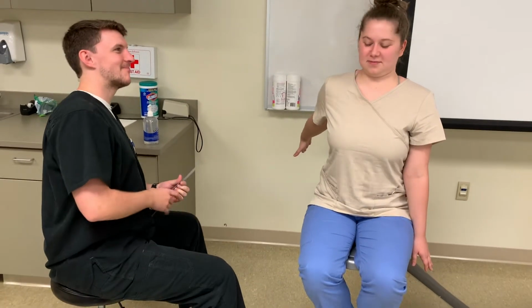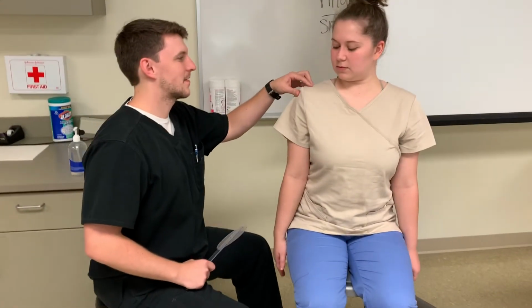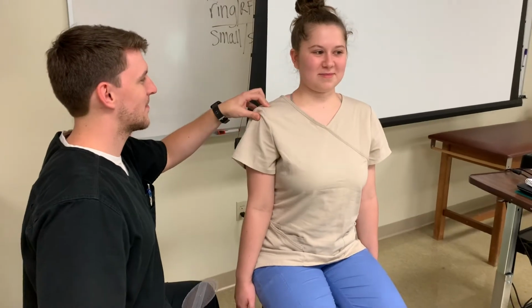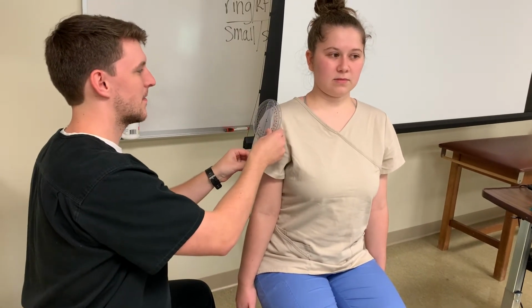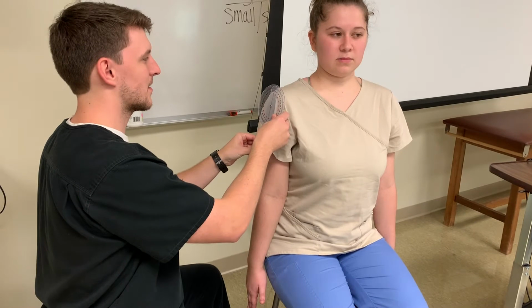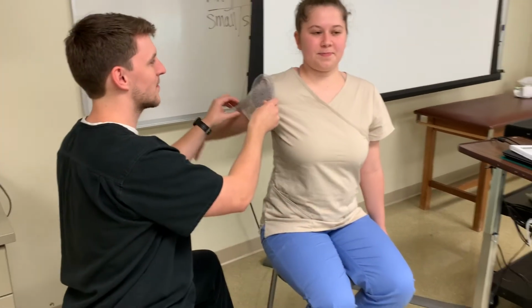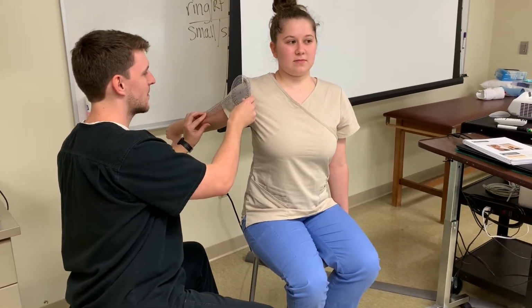Then, the practitioner will palpate for the inferior lateral acromion process. This is where you will place the goniometer so that the fulcrum and axis of rotation are 2.5 centimeters below the acromion process through the glenohumeral joint. The stable arm should align with the lateral midline of trunk. Movable arm should align with the midline of the lateral humerus. Instruct your client to reach with their arm behind them as far as they can go.